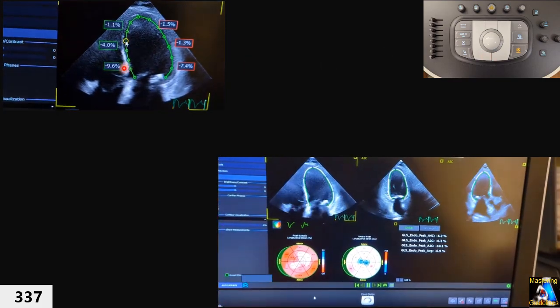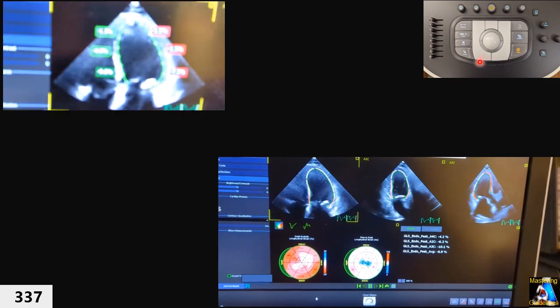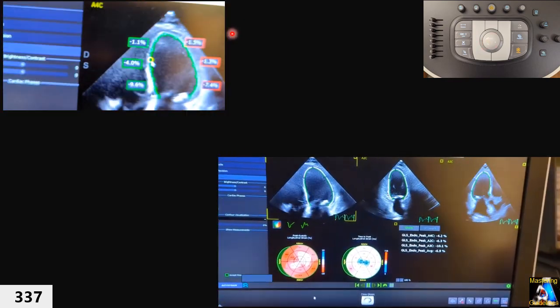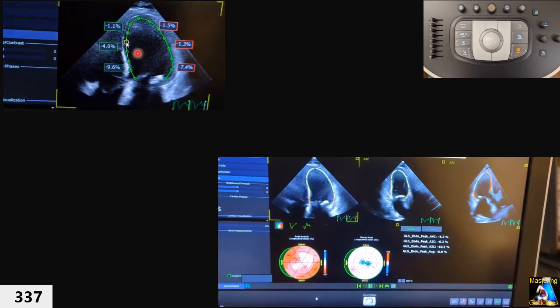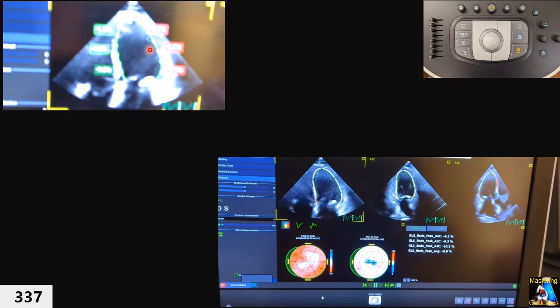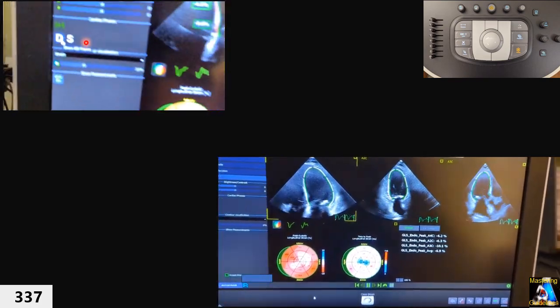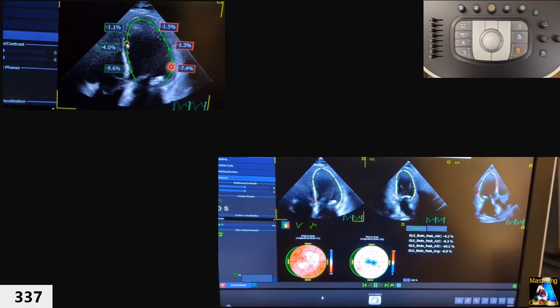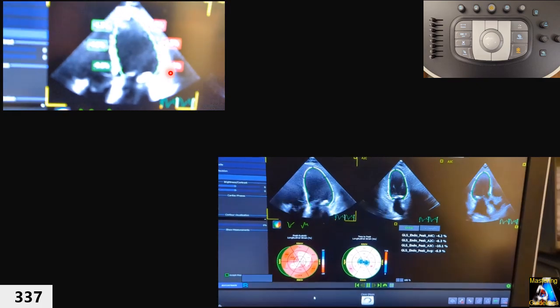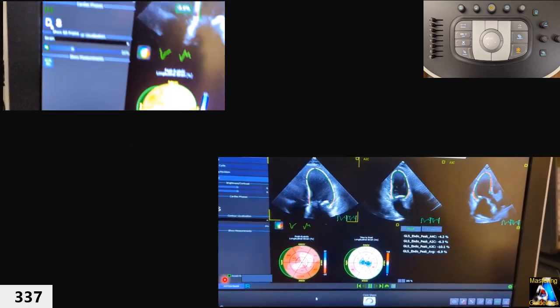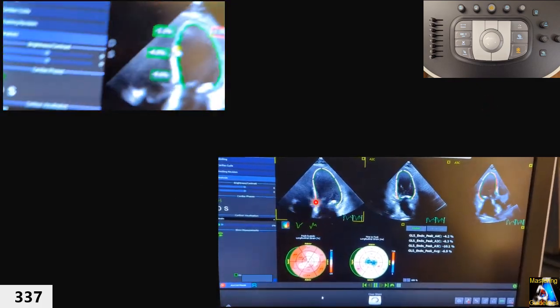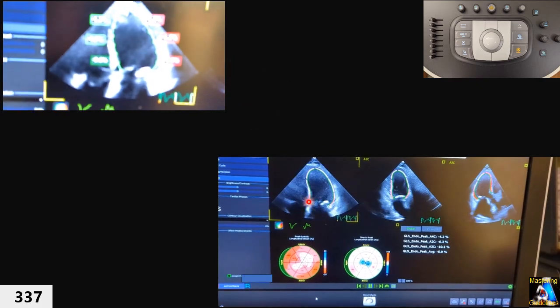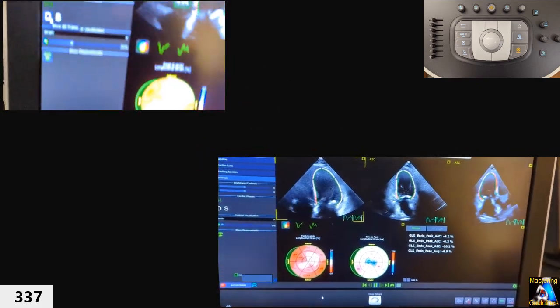After selecting diastole, hold the center select key and use the trackball to move any individual segment left, right, in, or out as needed. When satisfied with the diastolic contour, click on 'S' for systole. The machine displays the frame at systolic time; adjust any segments you feel are off. When satisfied with both phases, click Analyze. The machine re-traces through the cardiac cycle — repeat this process until you are fully satisfied with the tracking.